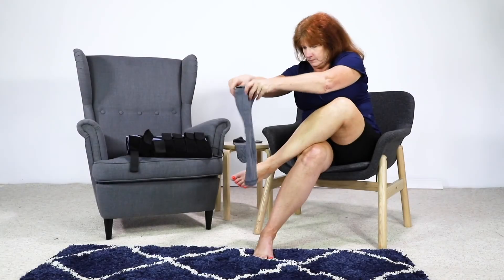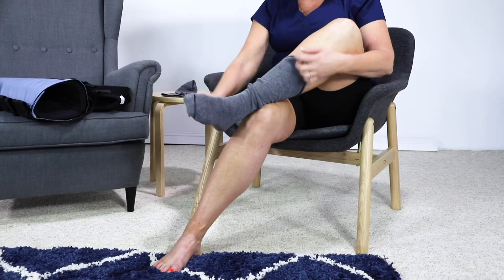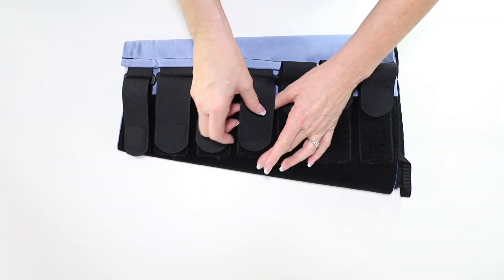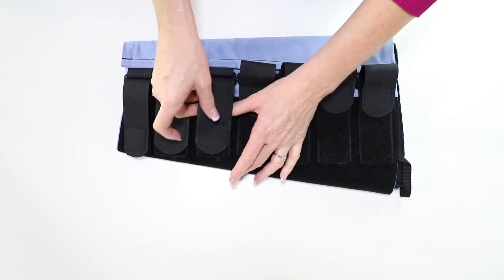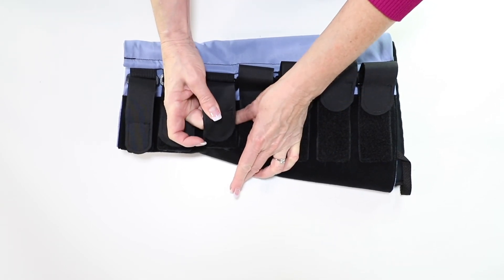To begin, make sure your skin is clean and dry, then apply one of the cotton liners. Before donning, loosen the straps on the Metaform. We recommend reattaching the straps to themselves to avoid tangling.